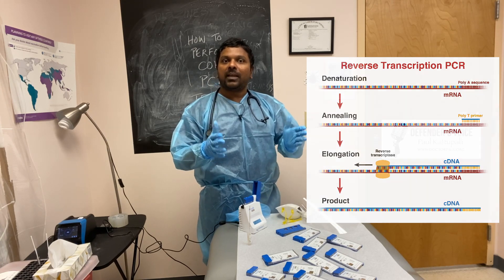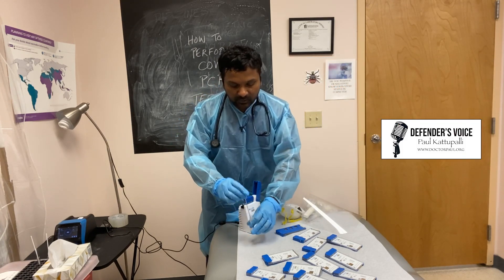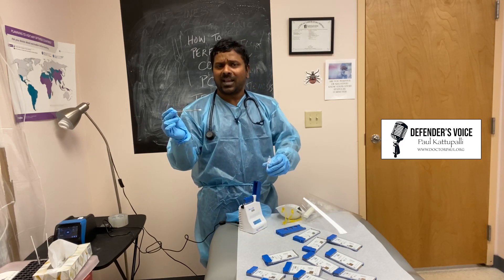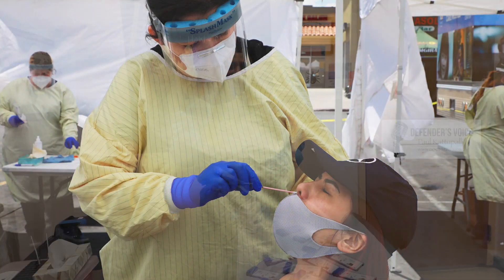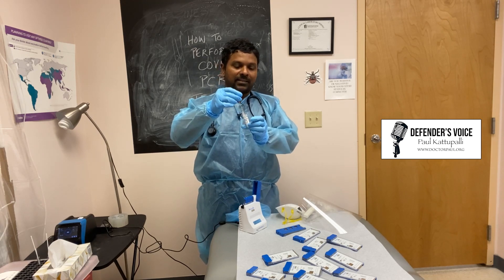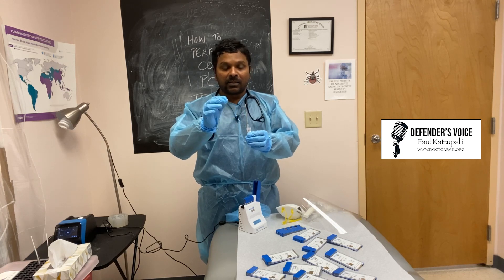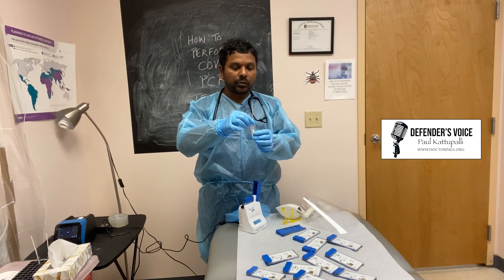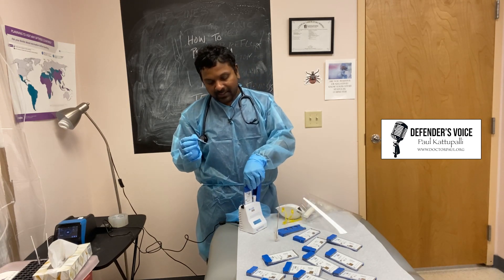We start with a normal nasal swab. You take this and go deep — nobody enjoys that. Put this in both nostrils and go as far as you can. Then keep it in this solution and mix it nicely. This pipette helps you transfer the solution into the cassette.